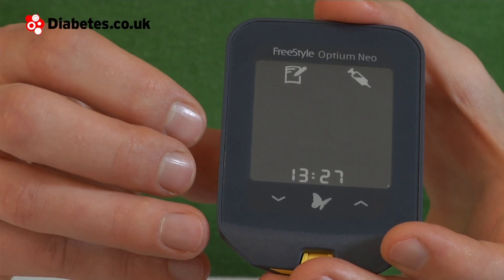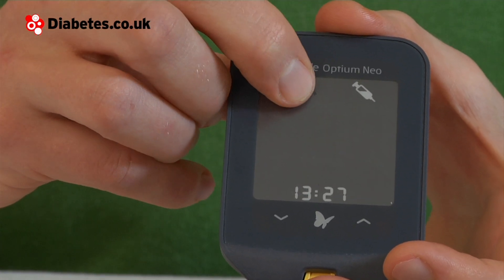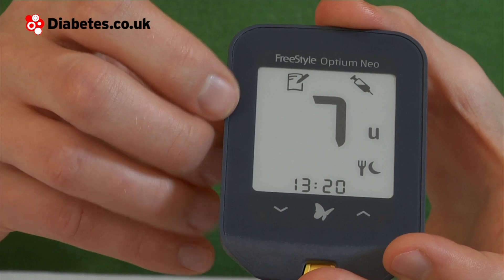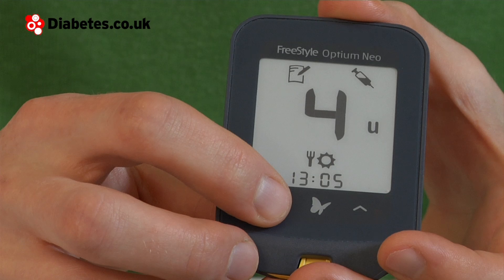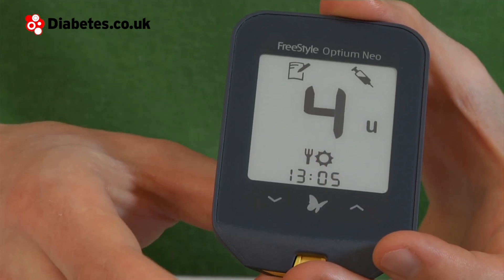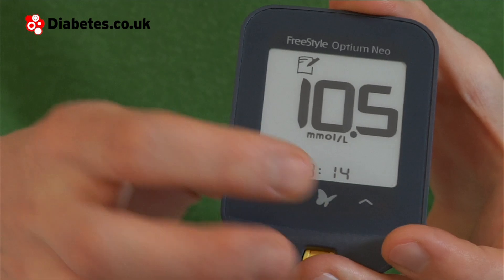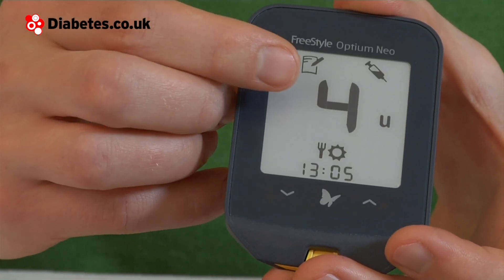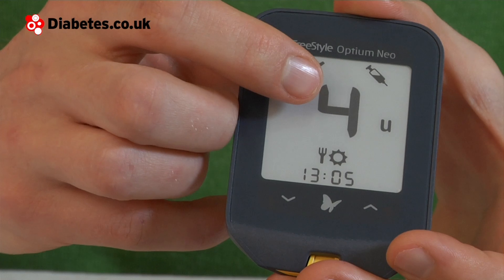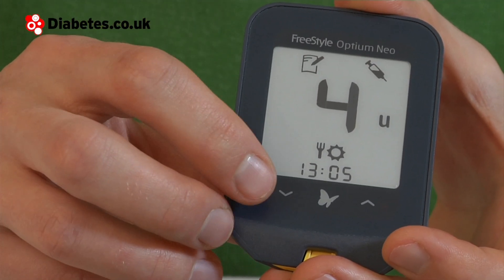To see your log readings, hit the log book icon in that top corner. Pressing that gives us a chance to scroll through our different readings. We can go up and down and show insulin log doses and also the blood glucose test results. If we have a look at one of the insulin doses, we see it's four units and it's a before lunch dose we took.